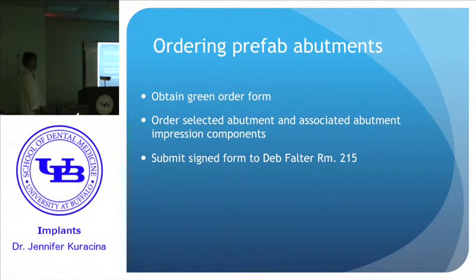So when you've selected the prefab abutment you want to use, you fill out that green order form. And again, if you don't want to have to worry about ordering all the parts you need, just get that all-in-one kit, and then you sign it and it goes to Deb.